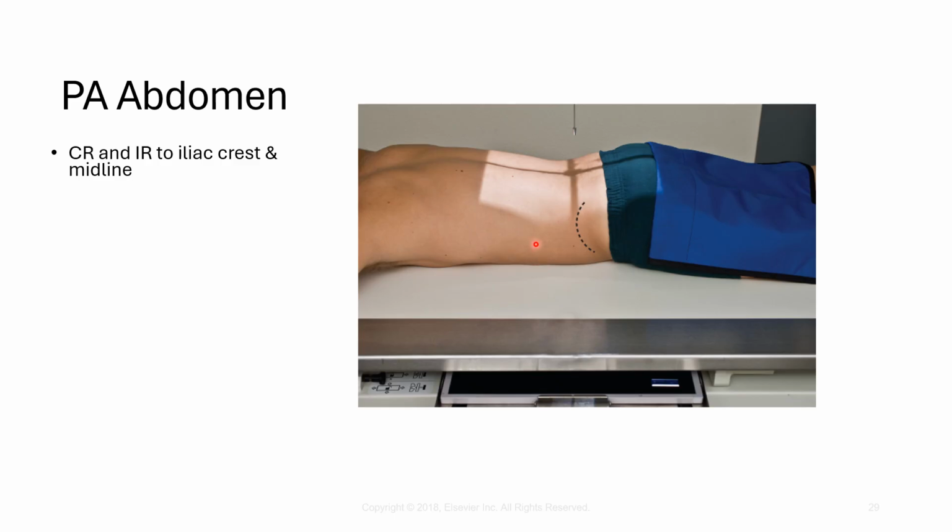It only requires pubic symphysis, which means that in this particular image and based on the book, they're telling you 1 image receptor, but I am telling you in the field on this patient, they would likely do a T-shot, which means this image they would expose, and then they would come back and do an image placed landscape to capture the diaphragm.